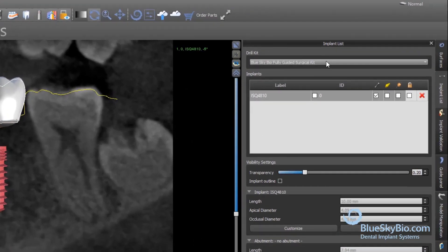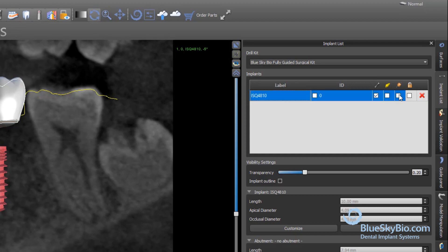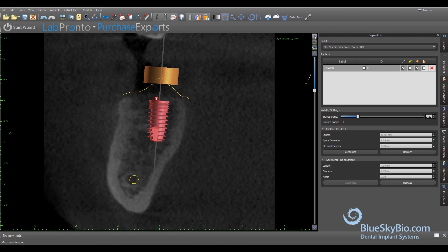In the drop-down menu at the top of the implant list panel, choose the fully guided keyless kit. This will automatically set all of the surgical guide tubes to the correct parameters.